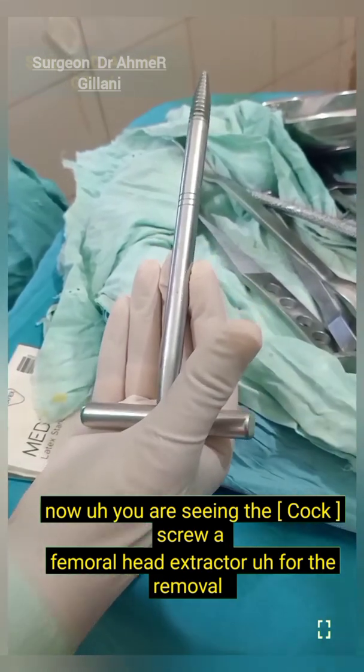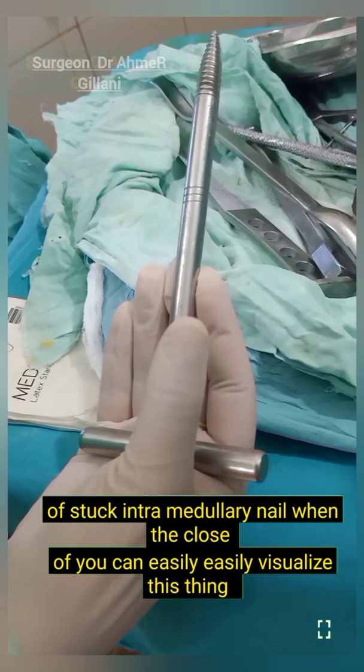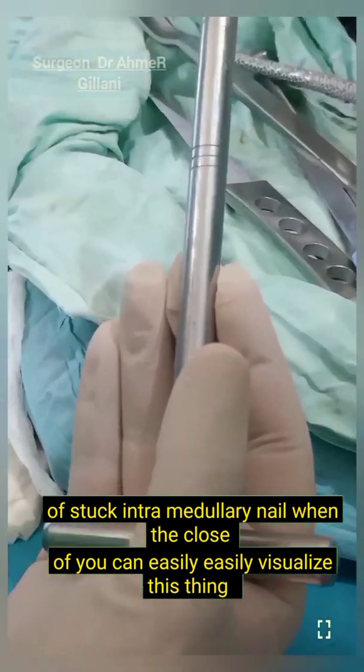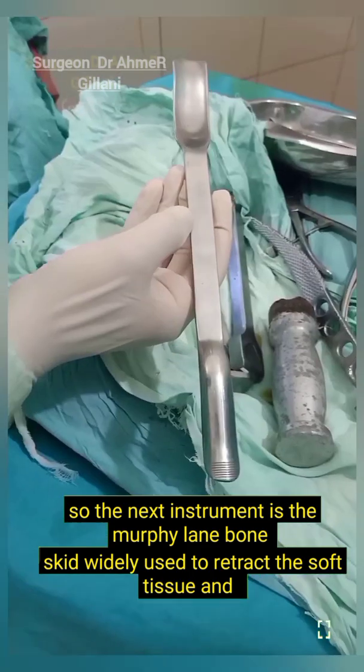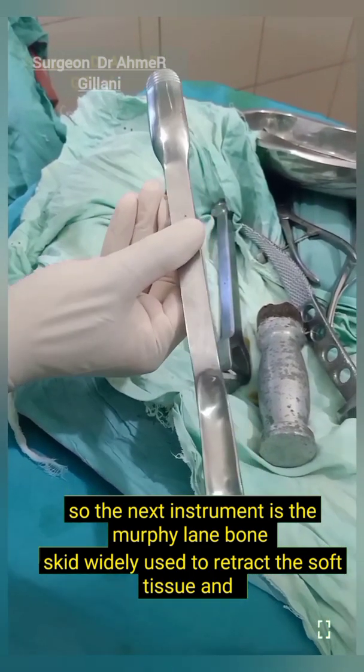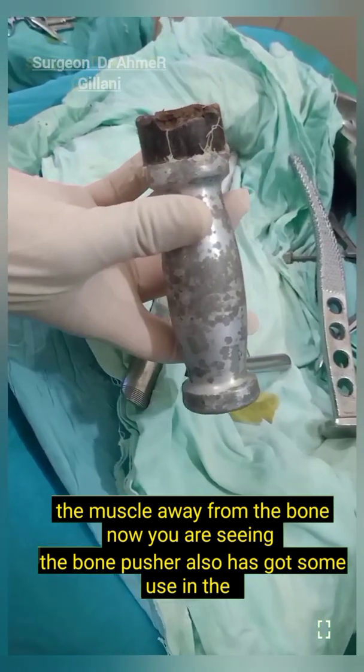Now you are seeing the corkscrew femoral head extractor, used for the removal of a stuck intramedullary nail. In close view you can easily visualize this. The next instrument is the Murphy Lane bone skid, which is widely used to retract soft tissue and muscle away from the bone.